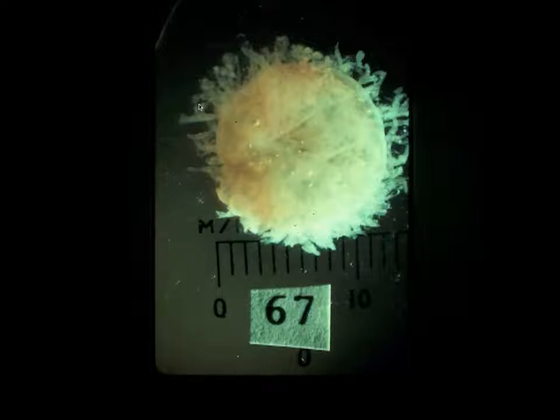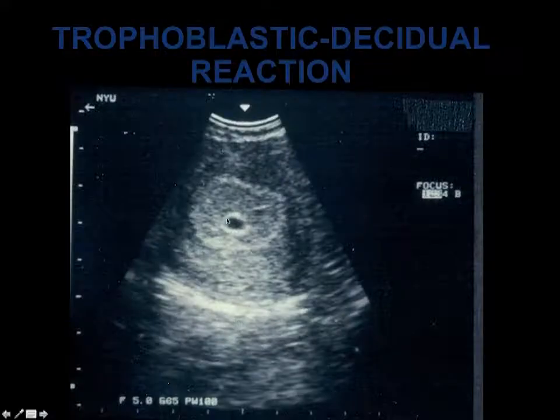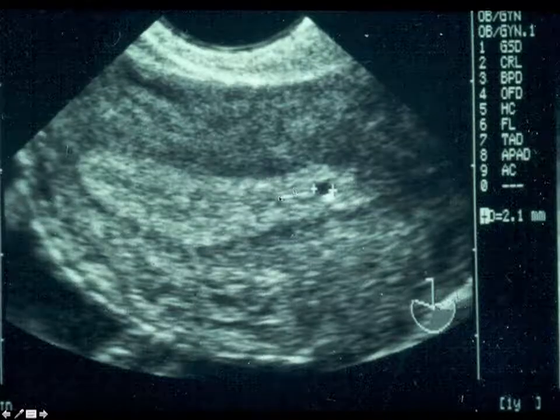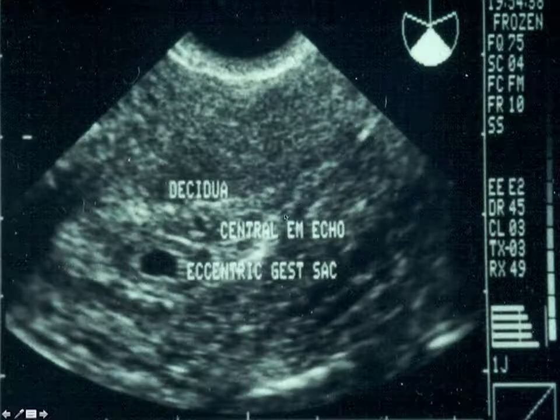But initially, these primary villi invade mom's decidua, and they produce this trophoblastic decidual reaction around the sonolucent center within the decidualized endometrium within the uterus. And this is what constitutes a gestational sac. Now, we talk about it being eccentric. Well, sure, here's the midline echo. Here's a tiny sac burrowing in anteriorly. Here's the midline echo, and here's a sac burrowing in posteriorly.